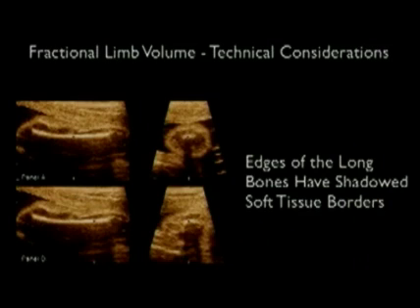Now, it's important to understand why we're emphasizing the middle portion of the limb, because if you take this panel A, and you can see the dot over here, corresponds to a cutting plane that creates an axial cut of the limb, and you can see the axial limb over here. You can see the borders quite well. But if you go over to one side, one end or the other end, you can see that the edges of the soft tissue borders become fuzzy, and this is what we want to avoid. So that's why we emphasize the center of the limb.